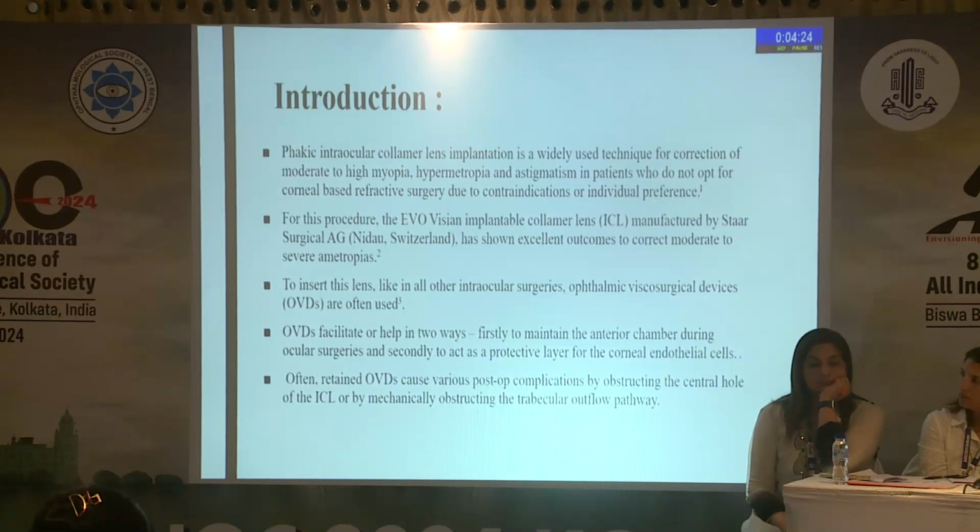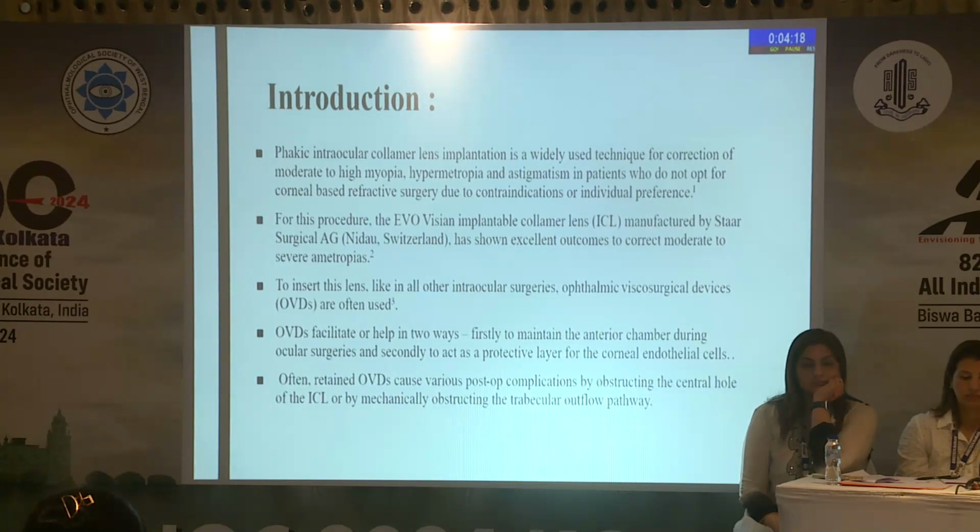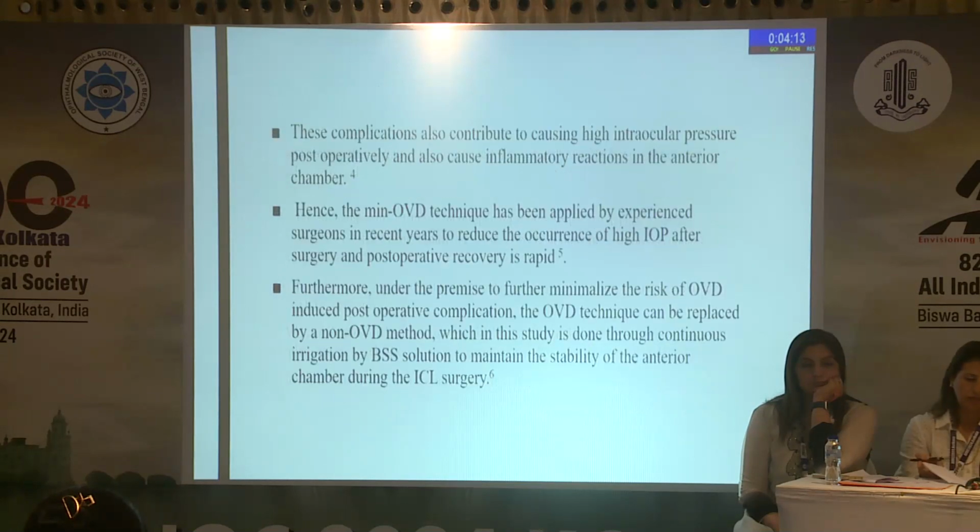But the retained OVDs, if they remain in the post-operative period, cause blockage of the central hole of the ICL, and they also mechanically block the trabecular meshwork. So these complications contribute to high IOP spikes post-operatively and also high inflammation in the post-operative period.